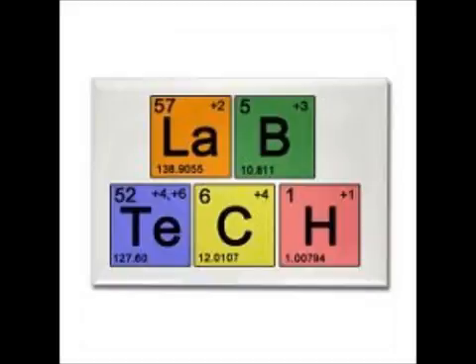Platelet-rich plasma. So we have 10% of light getting through. When you just take that plasma in a cuvette and put it in the spec, it's going to be pretty dark and not have much light shining through. Then you add the aggregator, so many microliters to the tube. Then there's a reaction time, you let it sit a little bit, then you put it in the spec again and see how much light clears. When you put it back in the spec, 85% of light gets through. So all those platelets clumped, fell out of solution, and it lightened, so a lot of light could get through.